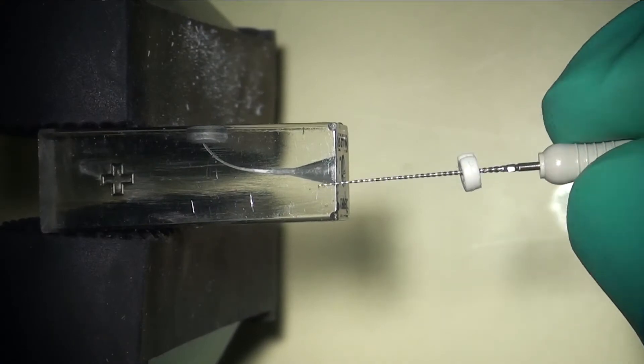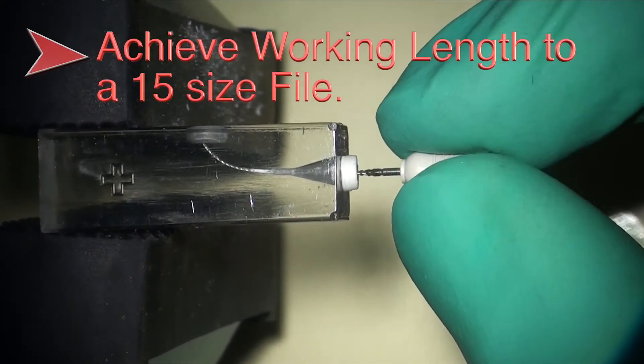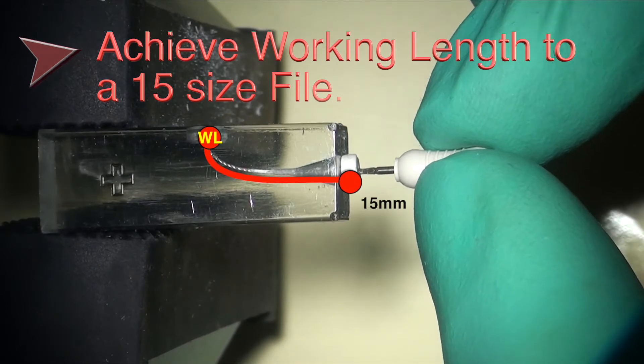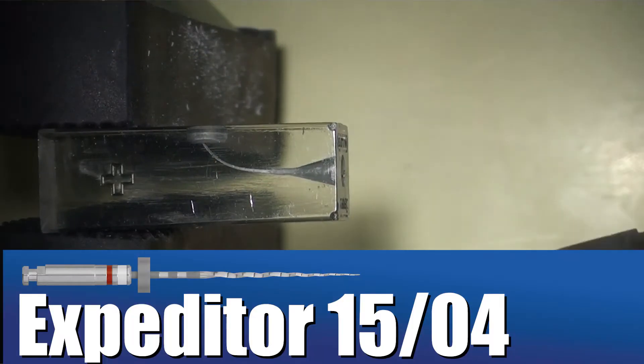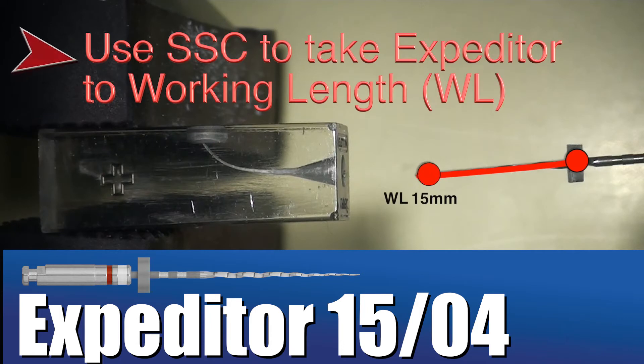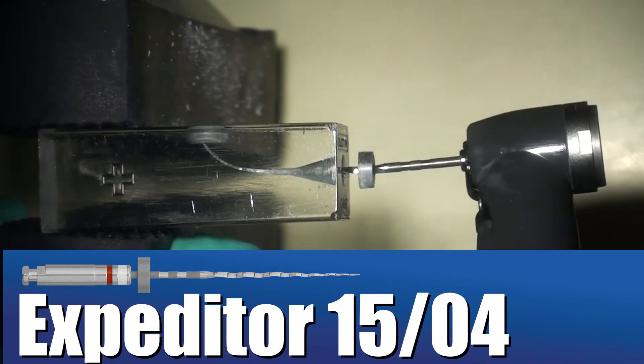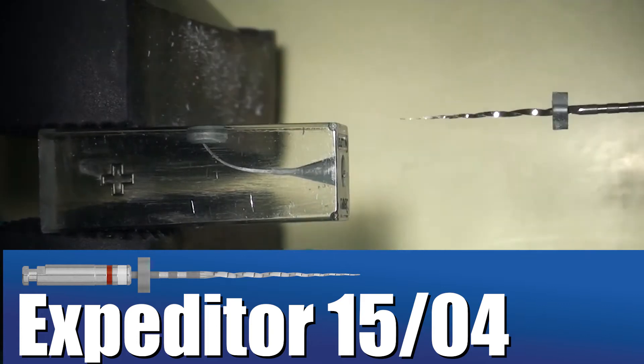The general protocol is to achieve working length with a 1502K file prior to using the Shaper. For advanced canals like the block shown here, it is recommended to gain additional taper to full working length with a 1504 or a comparable scouting file in order to allow the Shaper to spin freely and pulsate in the canal.